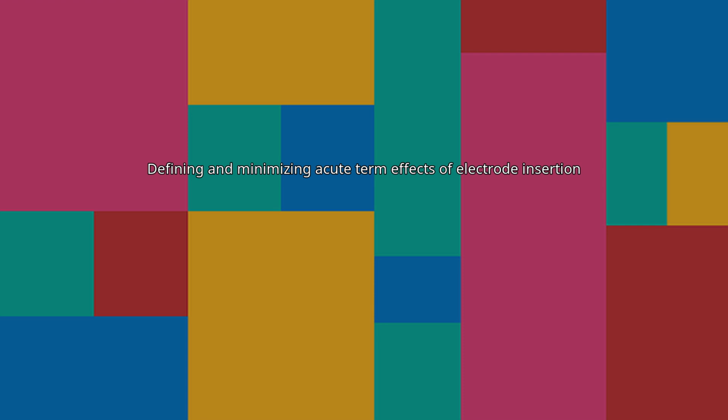Fluorescent microbeads lodged throughout the tissue, providing discrete coordinates that aided in computerized calculations of strain and deformation. Analysis of the images prompted the division of tissue damage into 4 categories: 1, fluid displacement; 2, vessel rupture; 3, vessel severing; and 4, vessel dragging. Fluid displacement by device insertion frequently resulted in ruptured vessels.